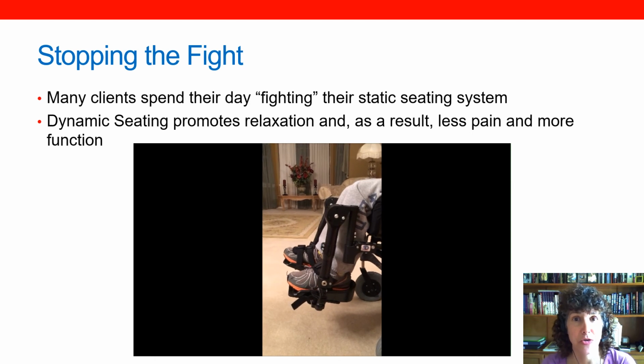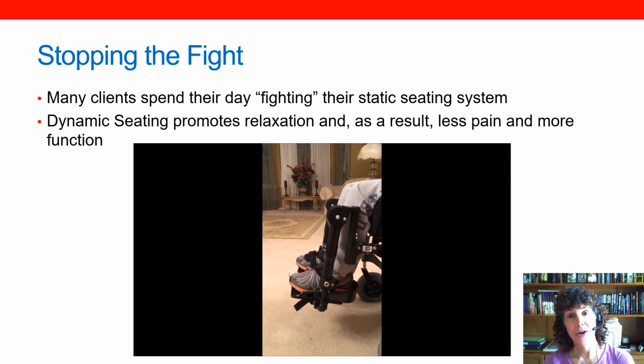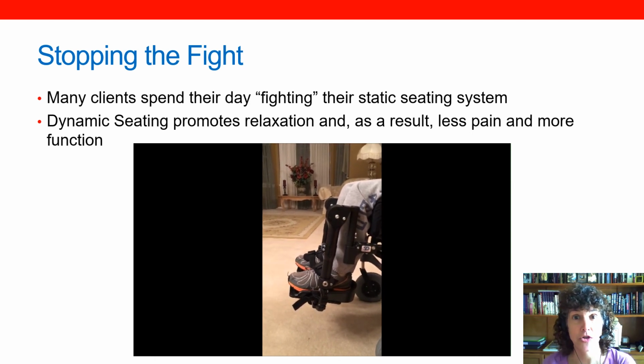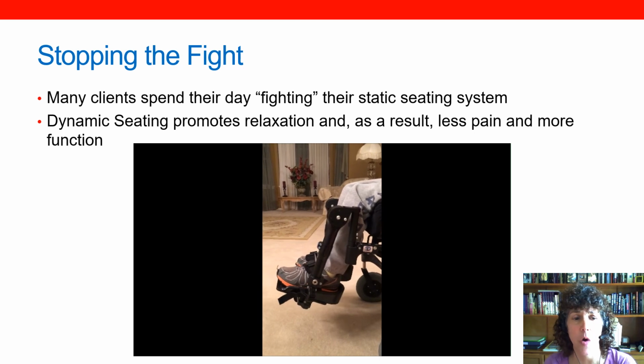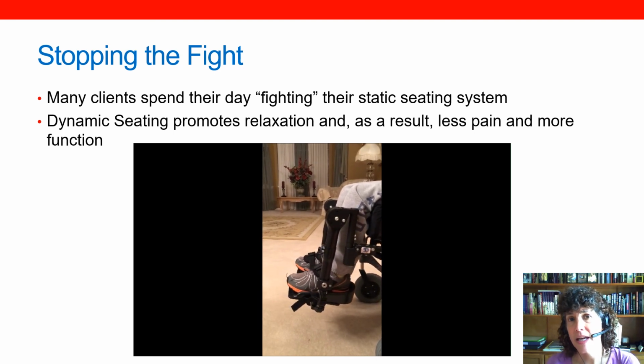This allows us to stop the fight. I don't know about you, but some of my clients look like their sole purpose throughout their day is to escape their seating system. They're fighting against a static seating system all day long. Dynamic seating diffuses those forces. It takes the wind out of their sails, and that helps promote relaxation. And as a result, this client may experience less pain and more function.